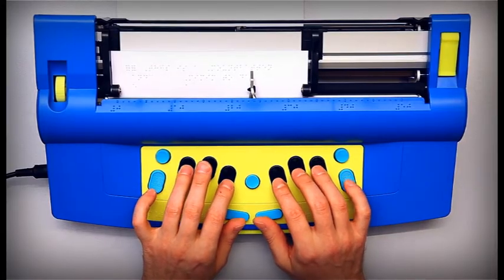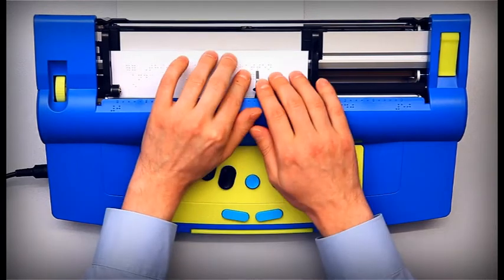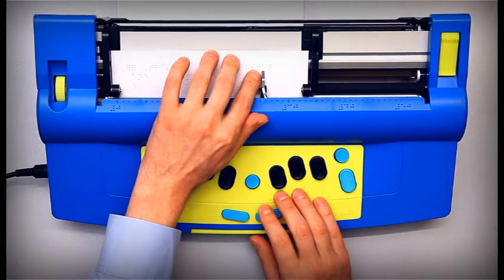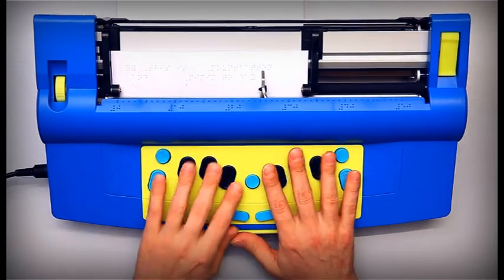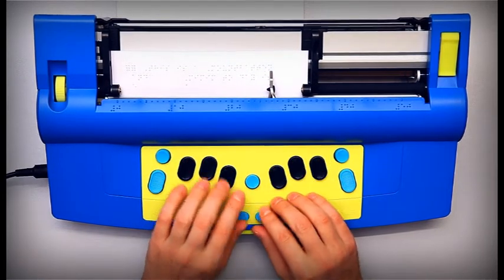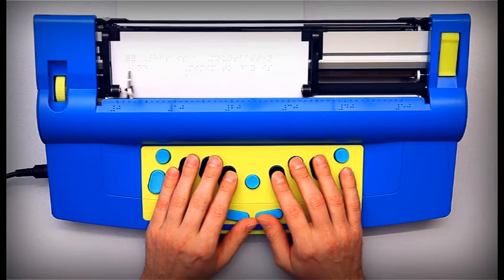In the Mountbatten we have two word wrap states, on and off. By default it is off, which means that if the word you are typing does not fit in the line, the Mountbatten places a hyphen, moves to the next line and keeps brailling.